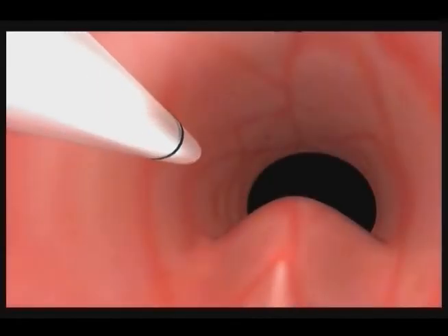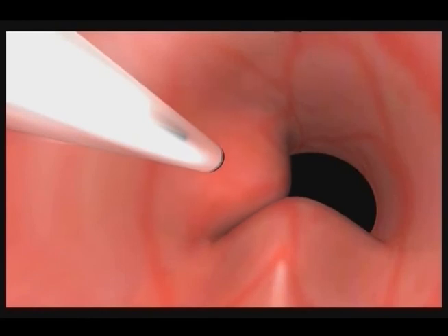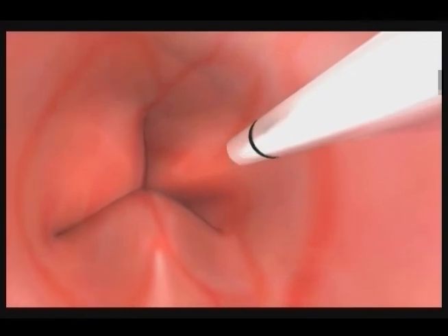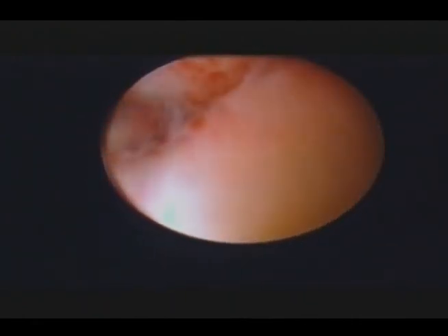You will use the second 2.5 milliliter Macroplastique syringe to create boluses in the 10 and 2 o'clock positions. Each of these boluses will hold approximately one half of a syringe, about 1.25 milliliters of Macroplastique. These boluses are created following the same tissue tunneling and injection procedure as demonstrated with the 6 o'clock location.